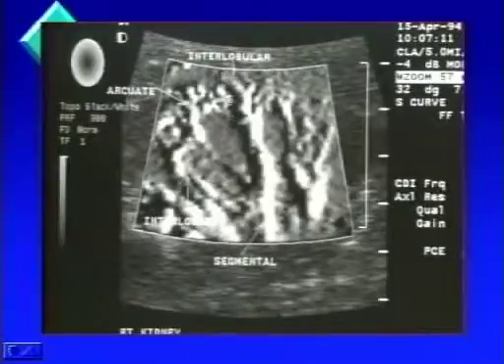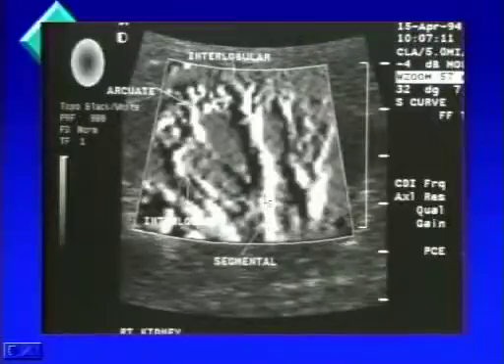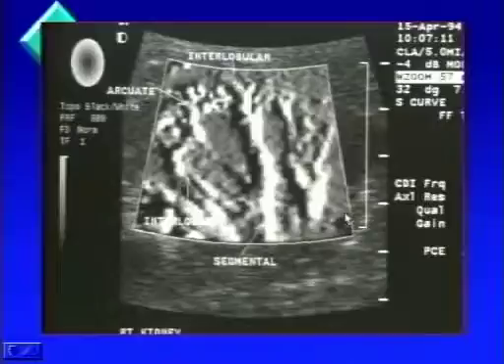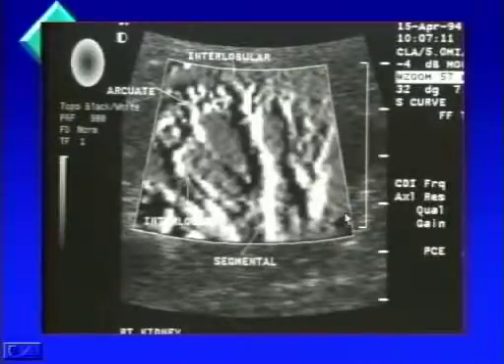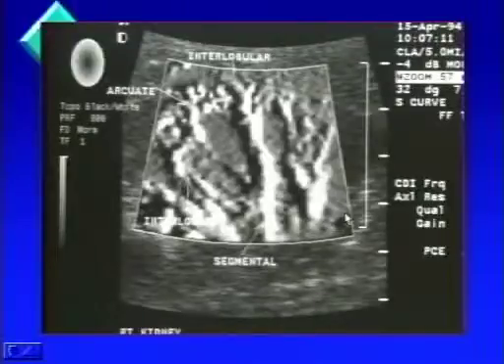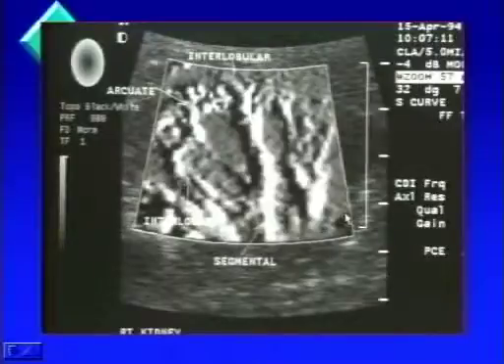With the indirect method, we will be taking a minimum of 3 samples of the segmental or interlobar arteries within the kidney. The theory behind this examination is that if we have a significant stenosis of the main renal artery at its origin that's greater than 60%, then that would affect perfusion to the kidney distally, and therefore we would see changes in waveform characteristics and also in time measurements in these vessels that are in the distal vasculature.